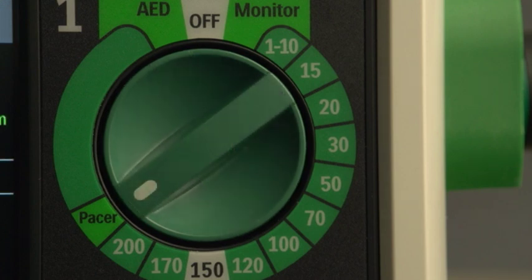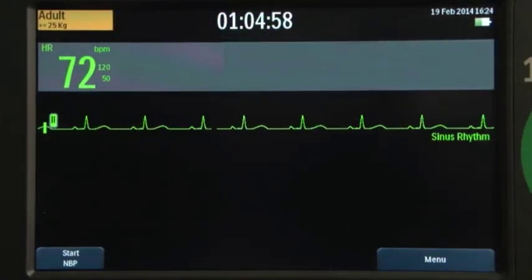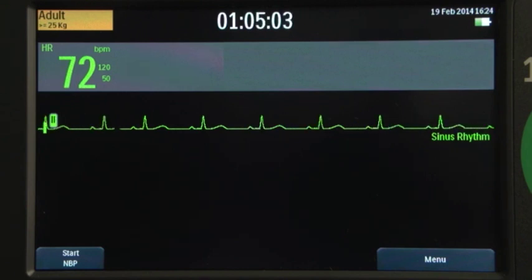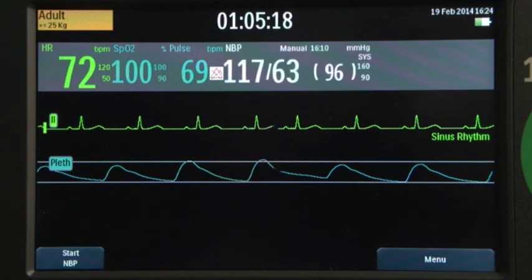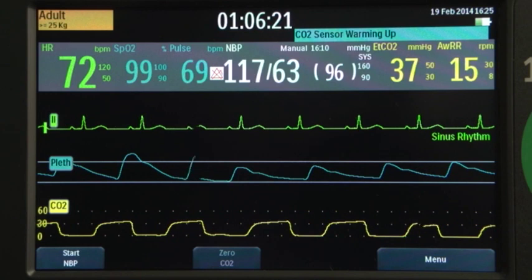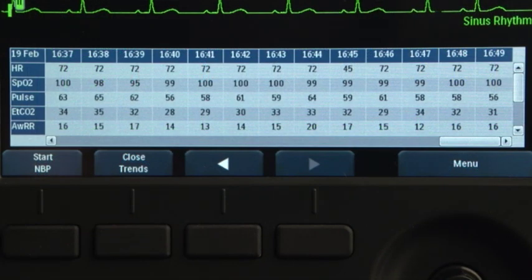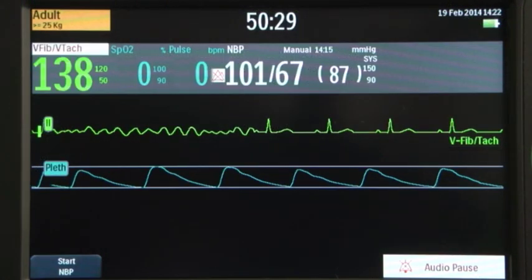In Monitor Mode, you can monitor one ECG waveform acquired through a three-lead ECG set and three ECG waveforms through a five-lead ECG set. Optional monitoring of pulse oximetry, non-invasive blood pressure, and/or end-tidal carbon dioxide is also available. The Officia DFM100 stores up to eight hours of monitored trending data that can be displayed in time intervals on the screen. While monitoring, alarms alert you to changes in the patient's condition.